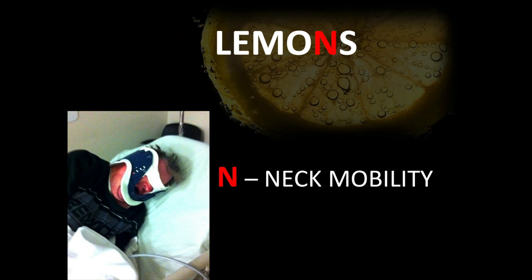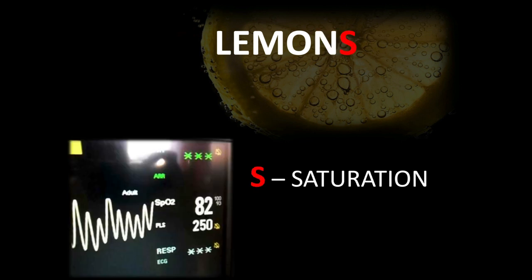And oftentimes what we always teach is have somebody hold from an anterior position from the chest to the neck, remove the collar or open it up if you have a collar on, and give yourself the best first chance at that intubation success by doing just that.